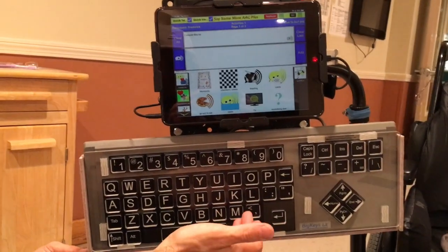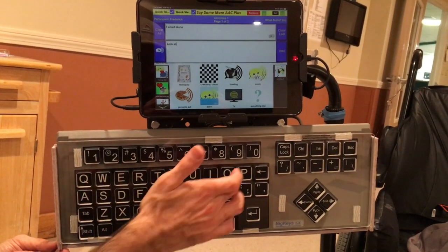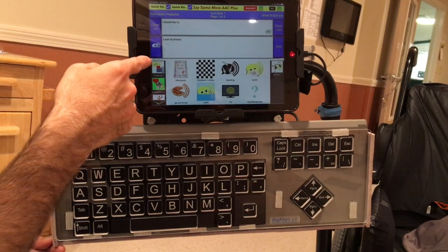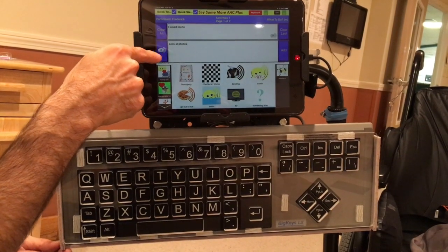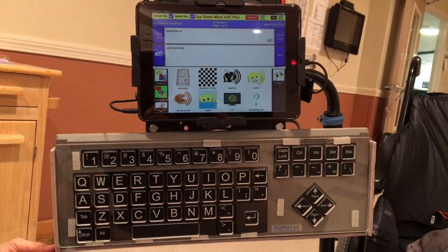I would like to look at photos. So he would type, look at photos. This one isn't going to speak automatically. To get this to speak, first you type the phrase, and then you press this white speech bubble in the blue background here. Look at photos. So it's a different voice for all the novel words.